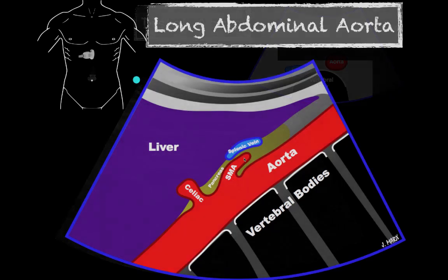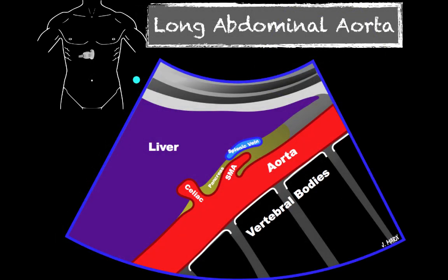After looking in the transverse view, I like to go back and look with a long view of the abdominal aorta. This allows me to look a little more proximal and up into the chest — I've caught some descending thoracic aortic aneurysms doing this. You're going to angle up into the chest a little, which gives this sloped appearance. You'll see vertebral bodies in the posterior with shadowing behind them, and your aorta will lay right on top. Probe marker toward the head, midline just slightly left — paramedial. You'll see the celiac trunk come off and the SMA, and you're also looking for saccular aneurysms that can get missed instead of the fusiform aneurysms you typically find in the transverse view.